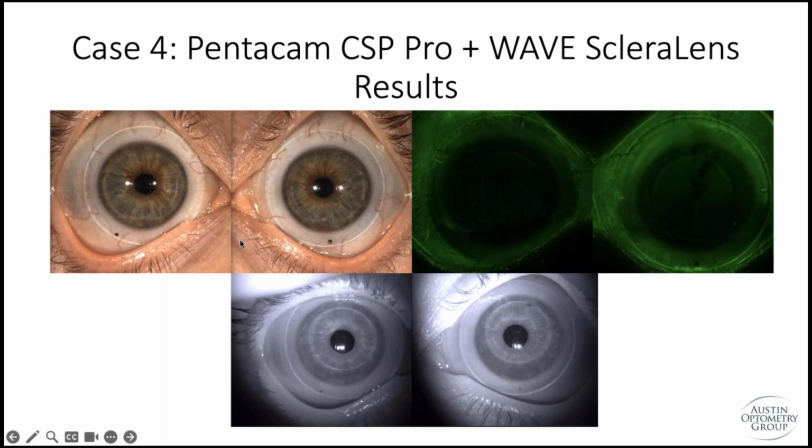Again, on the right eye, you'll see that dot rotating a little bit because that was about the 43 micron sclera. There's nothing to really do to keep that from happening, and that's fine. On the left eye, again, about 115 or something, so that's going to be pretty locked in.